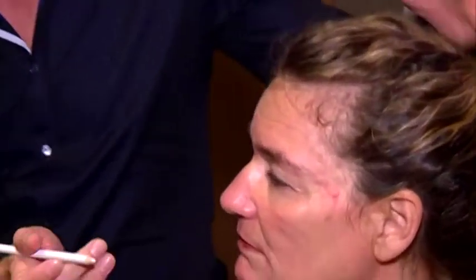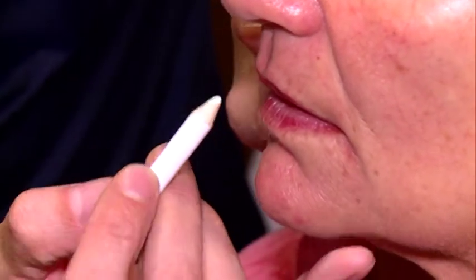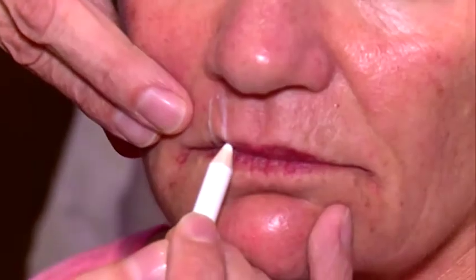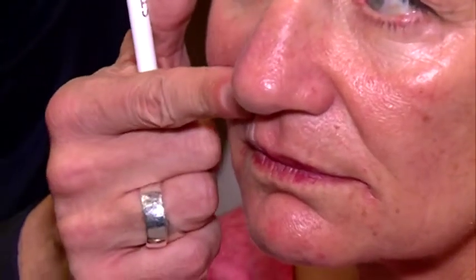Sometimes they say, okay, can I get a little bit more? And then I'm doing this way like you're doing it. Then I put it subdermally with the needle. I prefer the needle because I'm more precise. So then I'm going in here. Sorry, okay, close the mouth. Can we, Torsten, if you look at the camera, if the patient looks at the camera, so we can see, okay, thank you. So then I'm going in here and I'm doing a little line here just to volumize the lip subcutaneously. But the more I'm injecting subcutaneously, the more projection I get outward, which I do not want because I want an eversion more. And that's a kind of resistance that everts my lip like this, and this gives a quite natural result.